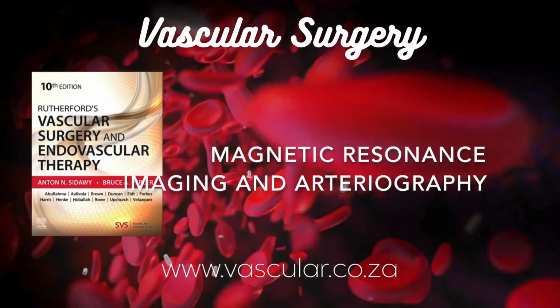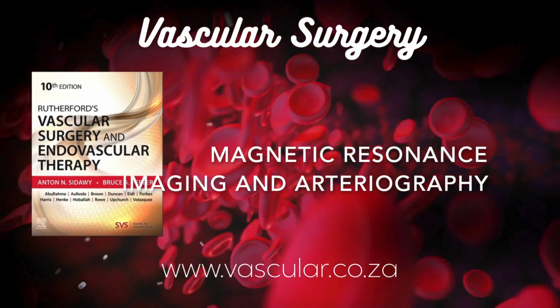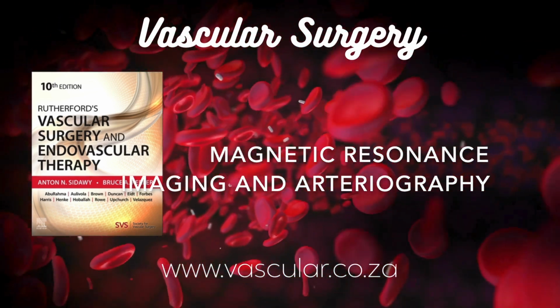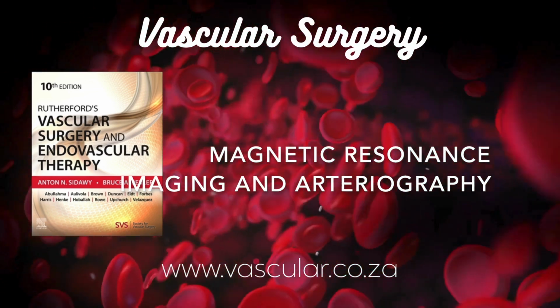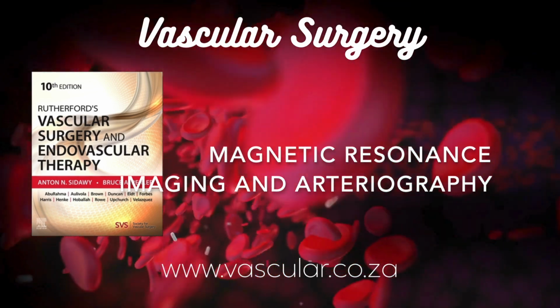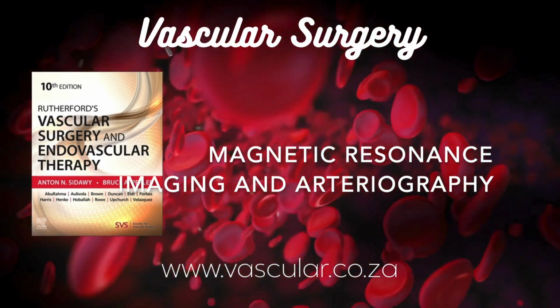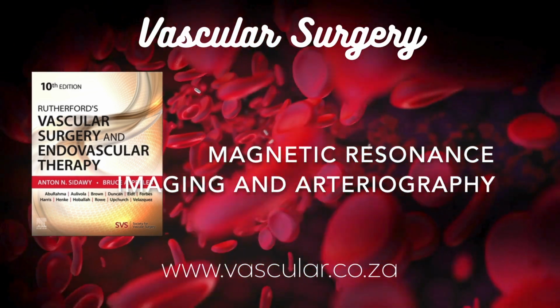Now, imaging large areas like the whole aorta or all the leg arteries, the outline mentions step table and continuous table MRA. What are these approaches? Yeah, when you need to image a long stretch of vessels, like from the belly down to the feet, doing it all in one single acquisition can be tricky. You might compromise on image quality or resolution, or maybe the timing of the contrast isn't perfect everywhere. So you break it up. Exactly.